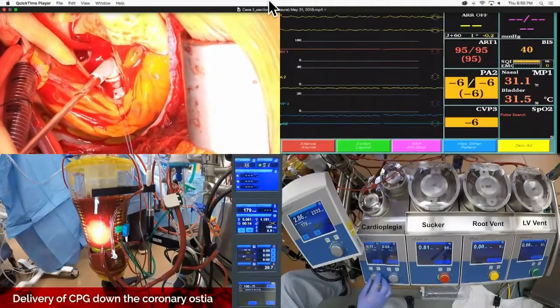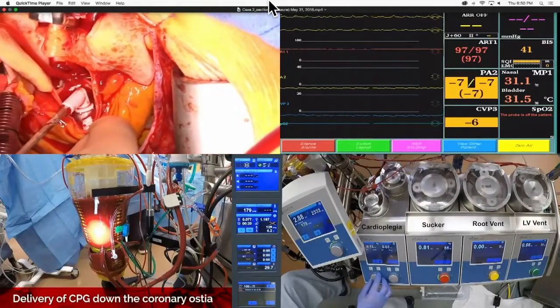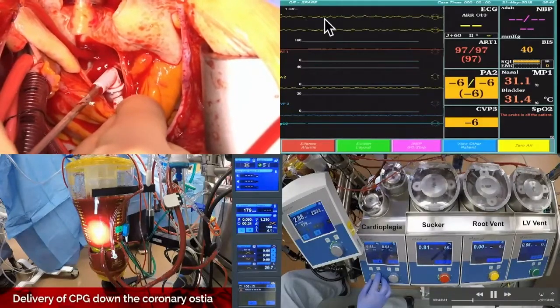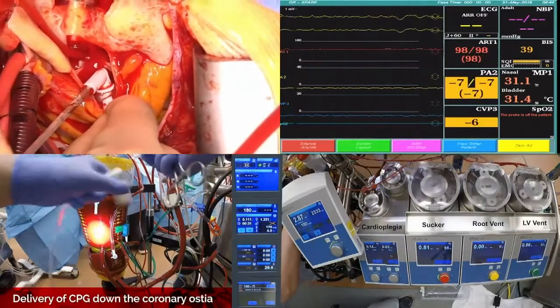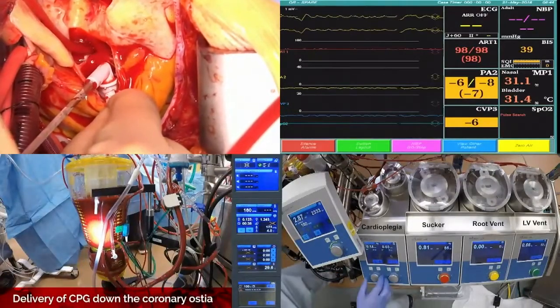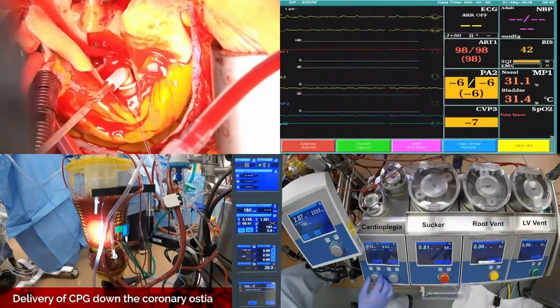On a straightforward aortic valve, like a replacement, I'll give at least one shot through the right and left main. It's a little bit time consuming, but I've found that the right heart really comes back with at least one shot during one of these. Typically, my cross clamp for a traditional aortic valve is less than an hour. Anywhere from 38 to 52 minutes is kind of my average.